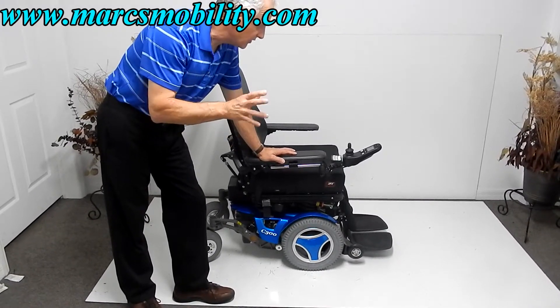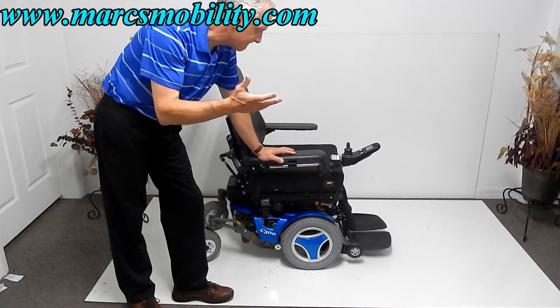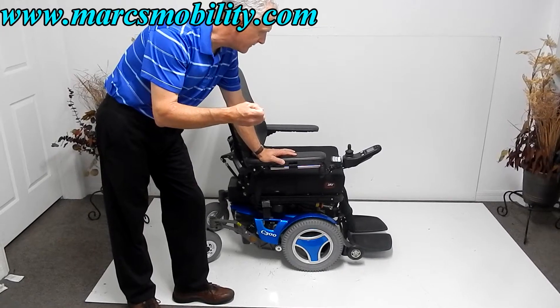It only has 12 miles. So 12 miles will be maybe 2 weeks of riding time — it's literally practically new.